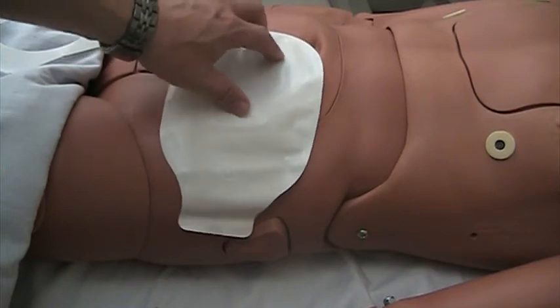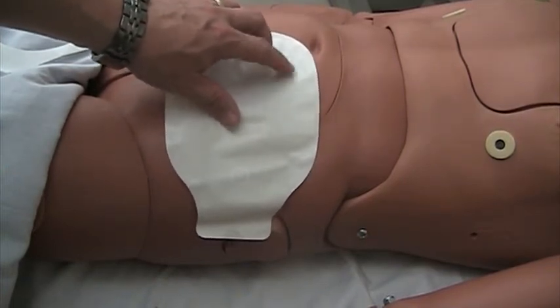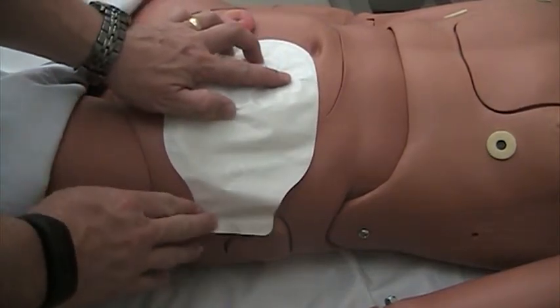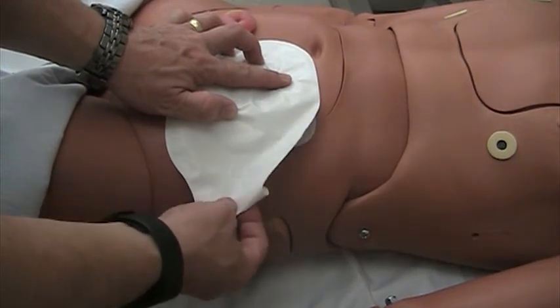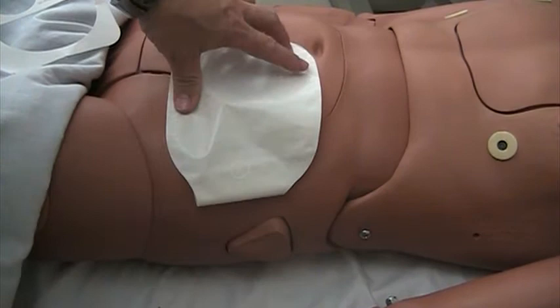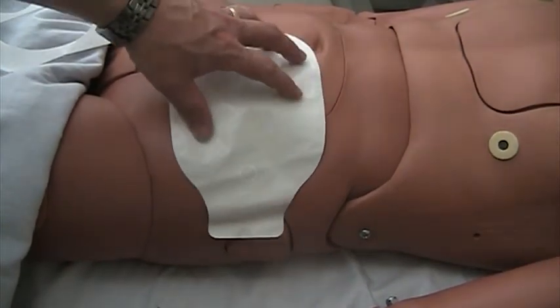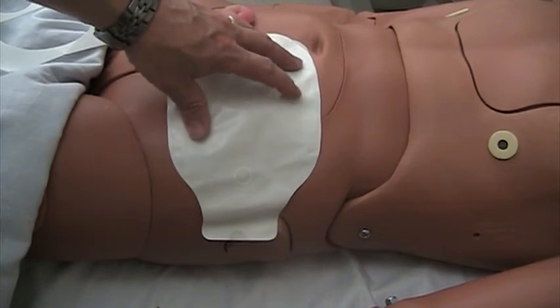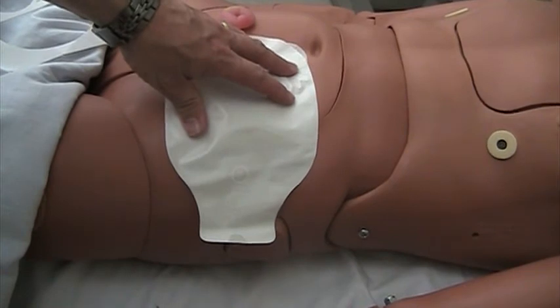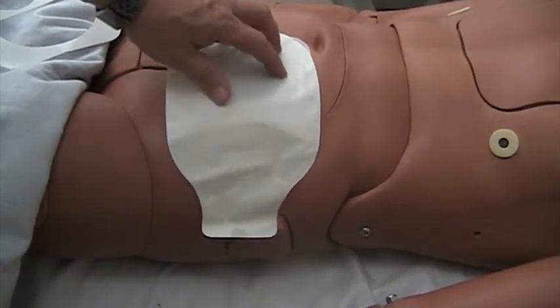Okay, so that bag actually seals, and this is a different bag for the type of wafer I'm using, but it would actually clamp on, and then you would take the clip, roll this up, clip that, and then this pouch is what collects the feces. If somebody eats a lot of collards, what have you, that bag's going to blow right on up, and you have to what's called burp the bag. You take the clip off, get all the air out, and it smells, yes, just like somebody passing gas. Okay, but that has to be done.